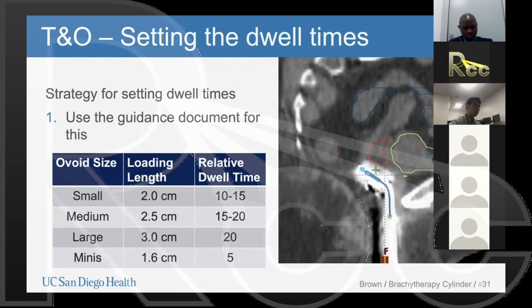So yes, in general, we would prefer to have exactly the same setup each time, but clinically that's not always the best option. The dosimetric impact is very, very difficult to assess because we have different anatomical positions each time. The best we can do is track the hottest 2cc volume for each one of our organs at risk, and then make a conservative assumption that those are exactly the same each time, which would be a worst case scenario because they almost certainly are not the same each time. Does that make sense, George?